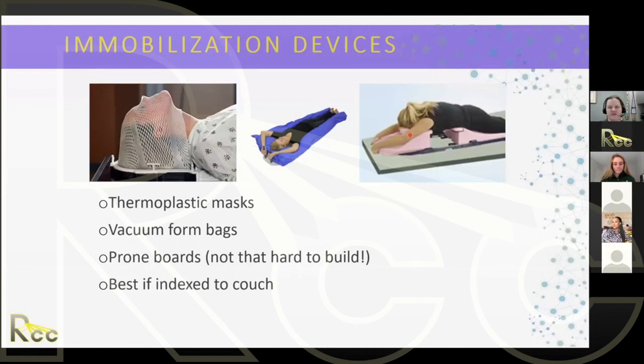The advantage of this position is, of course, that it is a respiratory motion management, because your chest wall here doesn't move because of your body weight on it, and all your breathing motion goes into the back where it doesn't interfere with treatment. At UC Davis, for patients that cannot be treated prone or that need a superclav or IM node treatment, which we cannot do with the prone approach, we do a very simple breath hold technique.